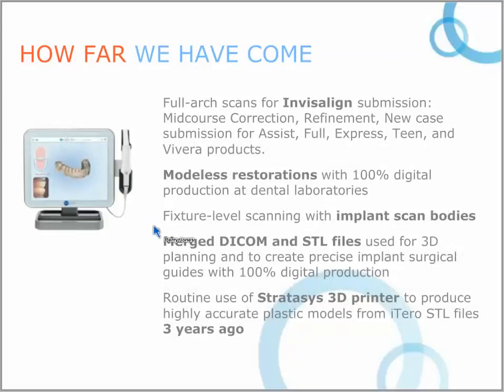Of course, we talked about the modelless restorations, the 100% workflow to be able to have labs make us modelless restorations. And we'll talk more about this in the coming weeks: implant scan bodies that we then can use to determine exactly where the head of the implant is actually located, so that we can, in the virtual world, make restorations for that. We'll learn to merge DICOM.